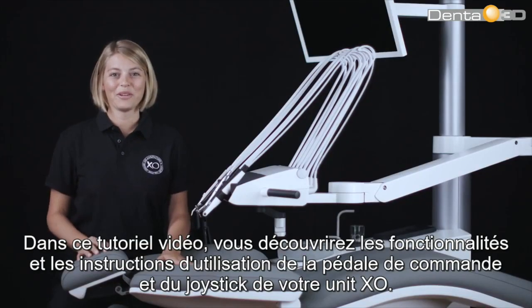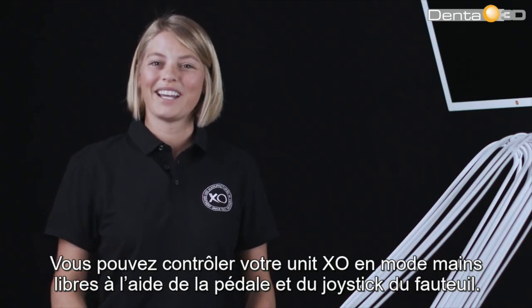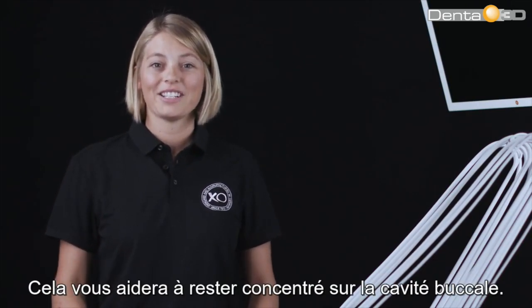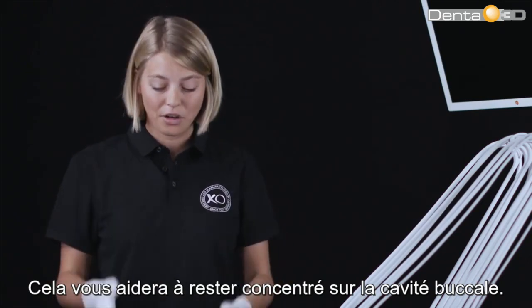In this video tutorial you will learn about the function and correct operation of the foot control and joystick of your XO unit. You can control your XO unit hands-free with the use of the foot control and chair-based joystick. This will help you stay focused on the oral cavity.